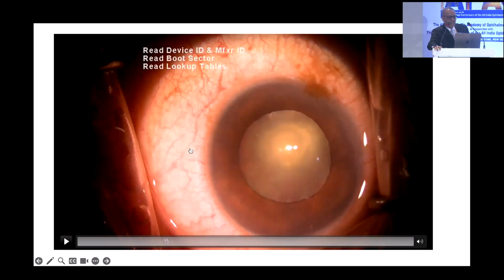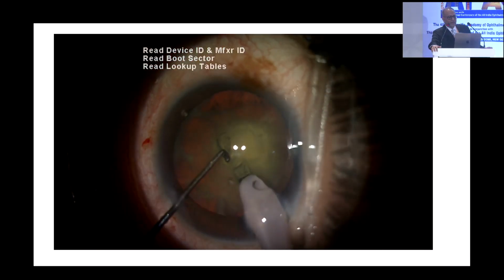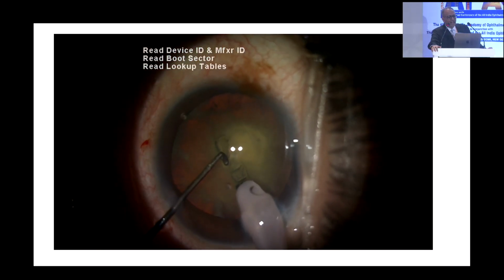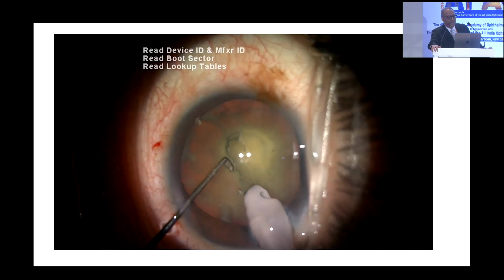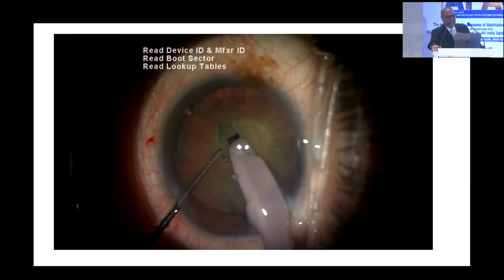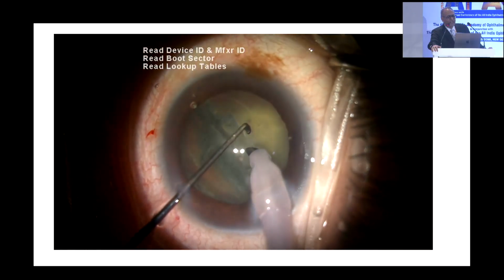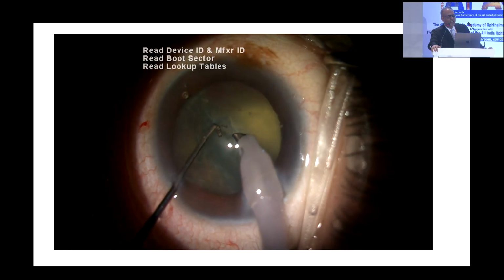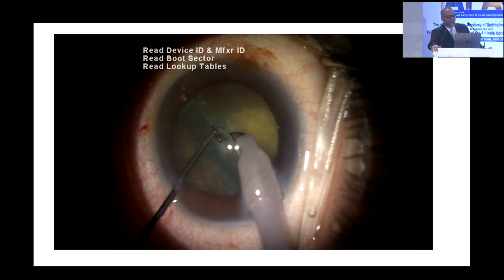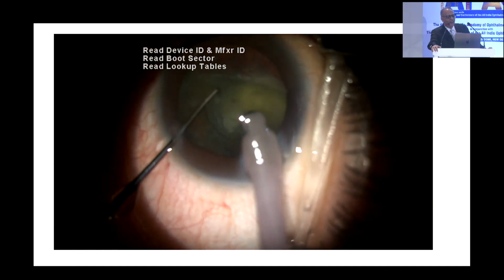So this is another situation wherein it is a posterior polar cataract. It's a very old movie. I'm going ahead, doing my bit of sculpting, pushing the nucleus, which should not have been done. It's a very deep chamber, trying to create a situation where I would do cross chopping, and I crossed everything, the limits, and you will find that suddenly it has gone behind.